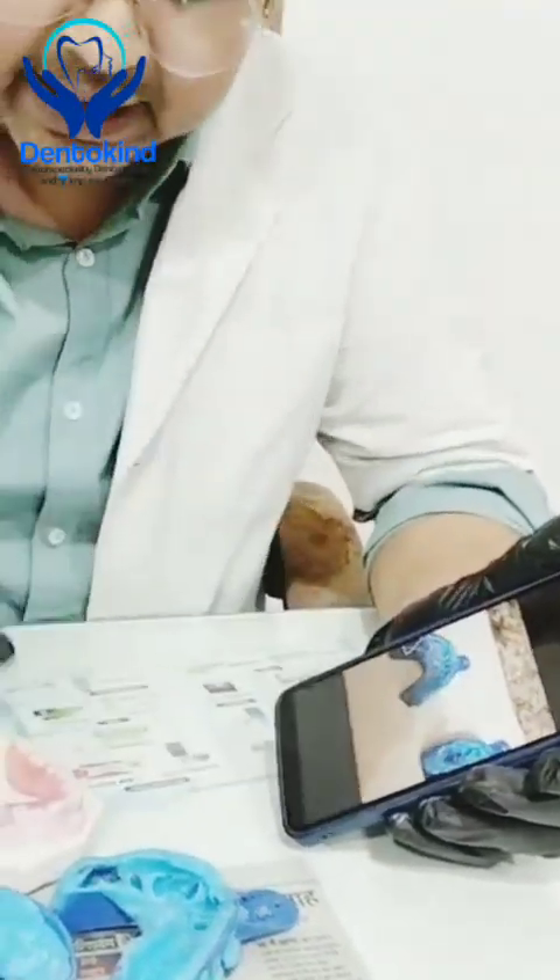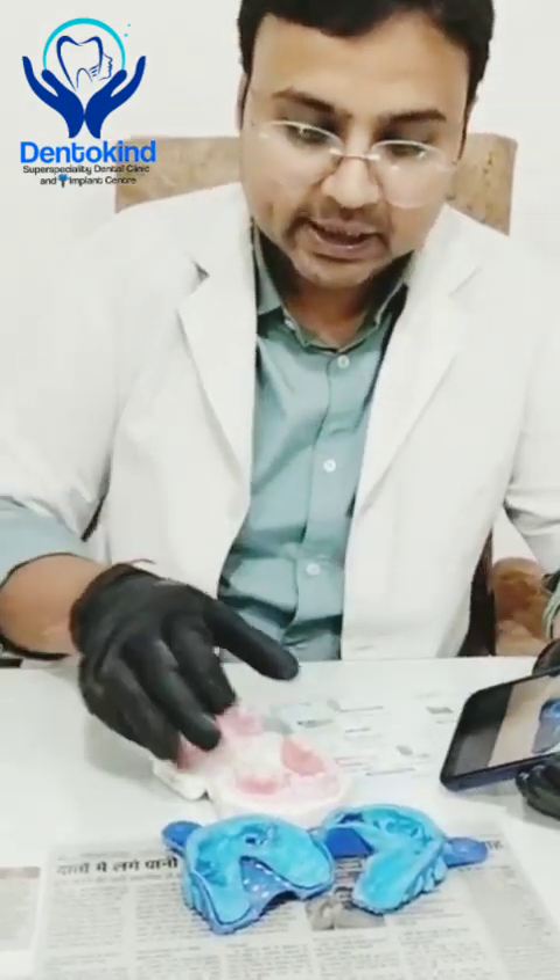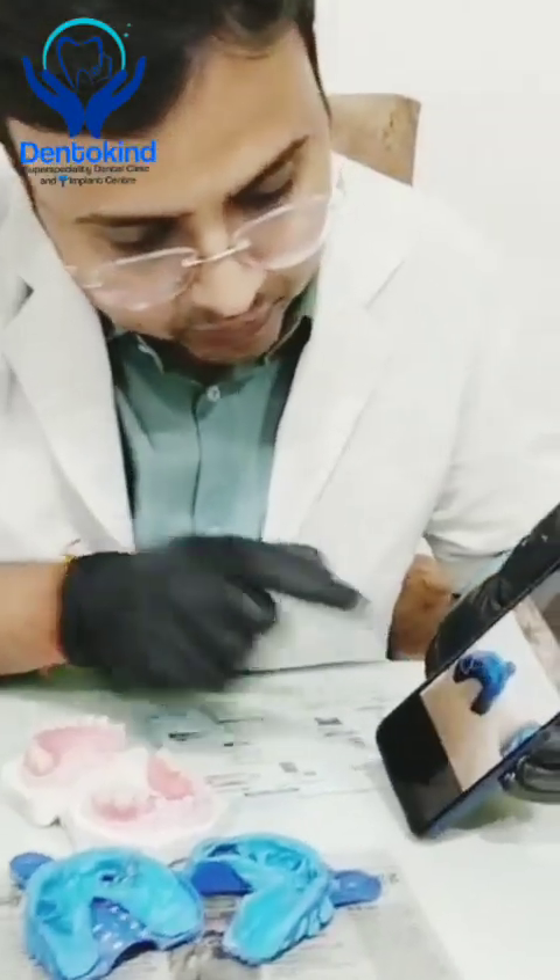They wanted us to omit these teeth and recreate a denture so that they can wear it in the event when these teeth are extracted or fall off. When these two teeth get extracted or fall off in the near future — like in one or two months — they already sent us the impression. From that impression we recreated it and omitted those two teeth. You can see now the lower jaw.